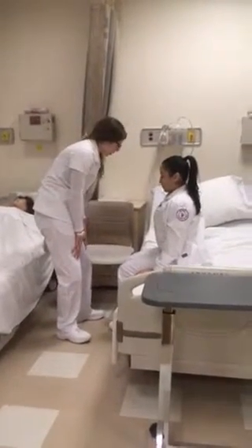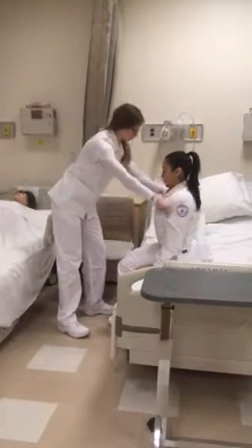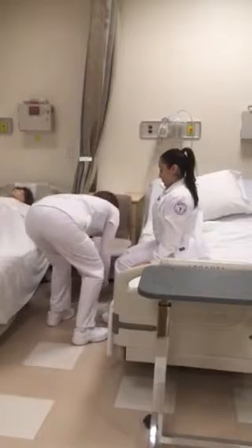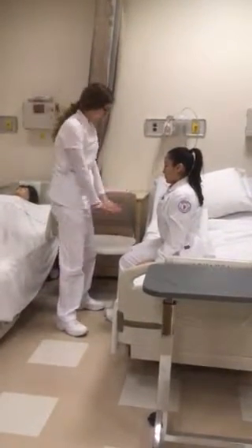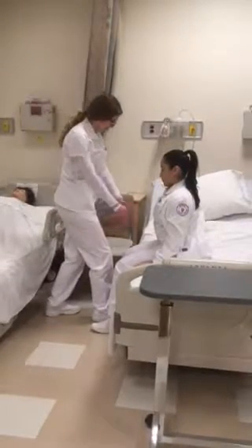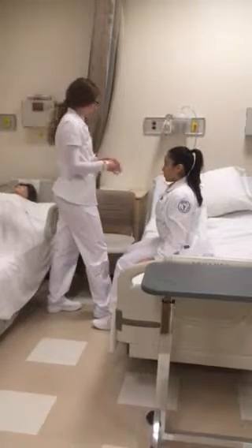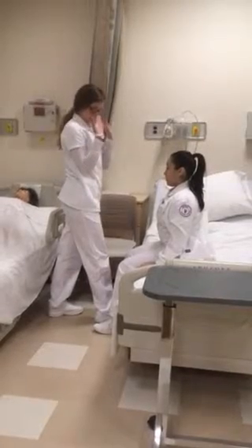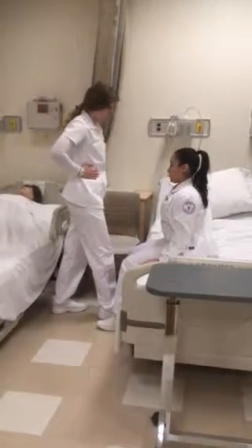No. Alright, perfect. So the next thing I'll do is I'm going to put their robe on. And we're just going to make sure they have their slip-resistant socks. There we go. Alright, so next you're going to spread your legs a little bit, please. And you are just going to have my foot be in between them, right? So we're going to try to lift you up from the bed into the wheelchair, okay? So what I want you to do is you're going to put your hands on my shoulders, right? And you're going to feel my hands on your waist, okay?